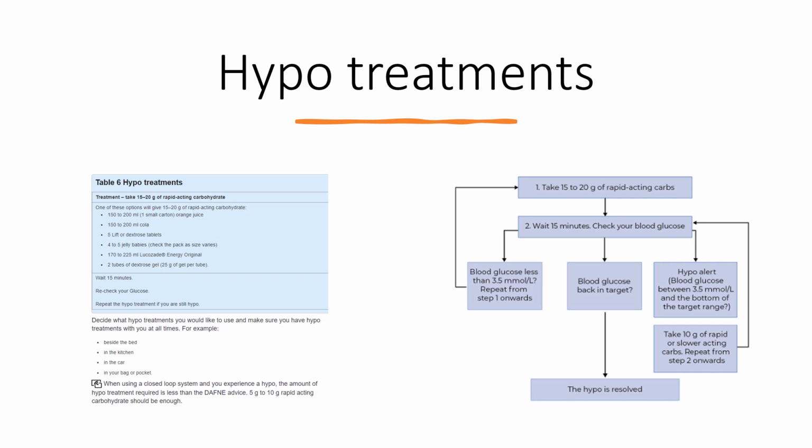The hypo alert and hypo guidance will bring blood glucose back into target. Following up with longer acting carbs will result in overshooting the target and above target glucose. In this situation, people are tempted to correct the above target glucose, resulting in roller coaster blood glucose and less time in range. CGM traces often show this pattern, and this is reflected in guidance for CGM users to refine the amount of carbs they take for below-range glucose.